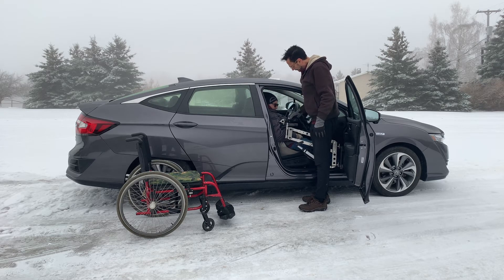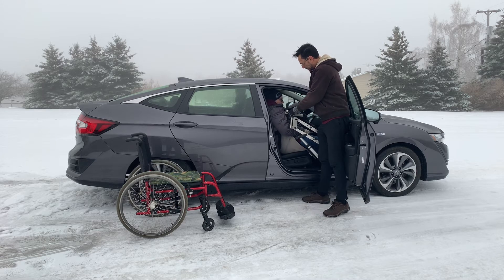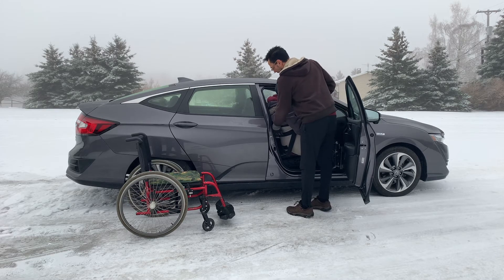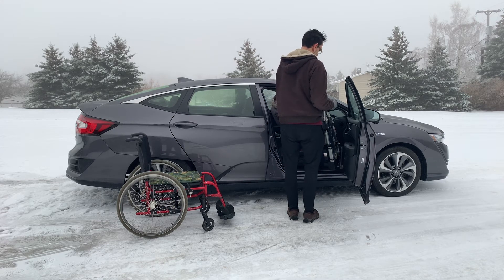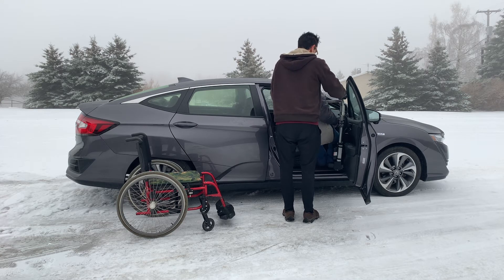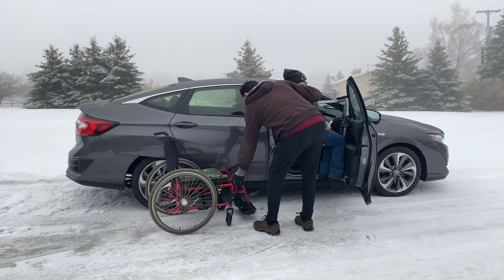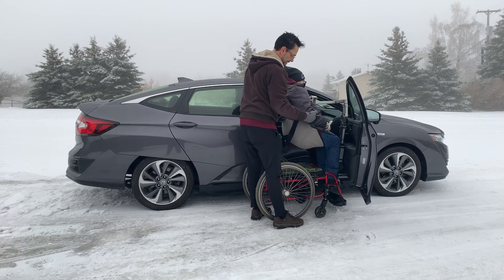Raise. When we come out of the vehicle we'll be traveling sort of a little bit outward. Once we're fully up and down into the wheelchair.